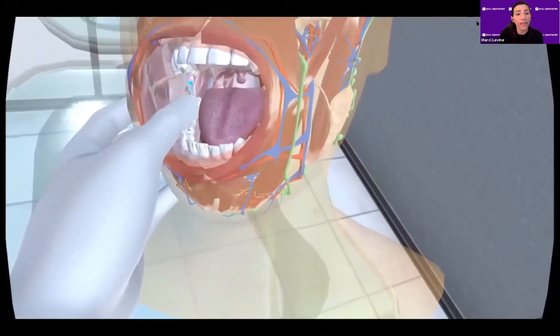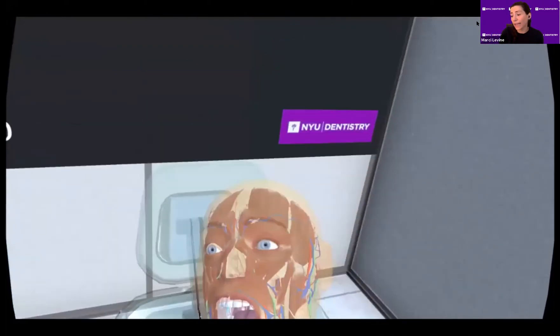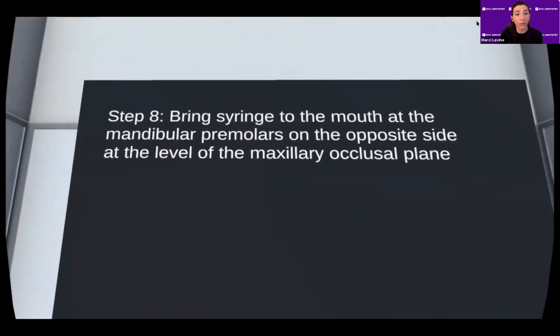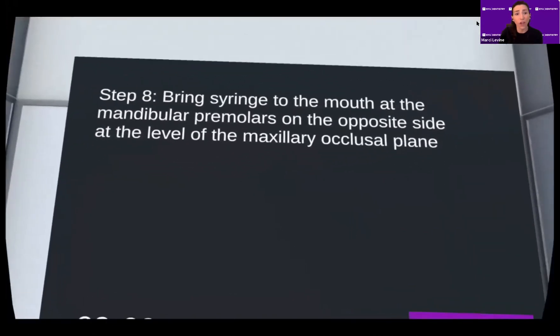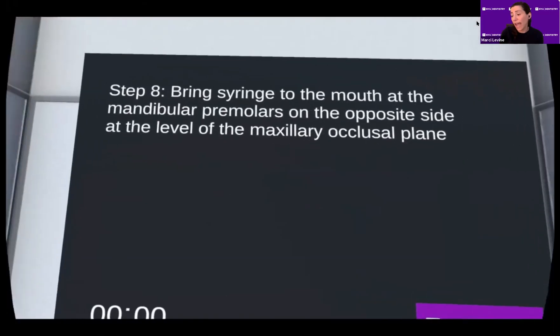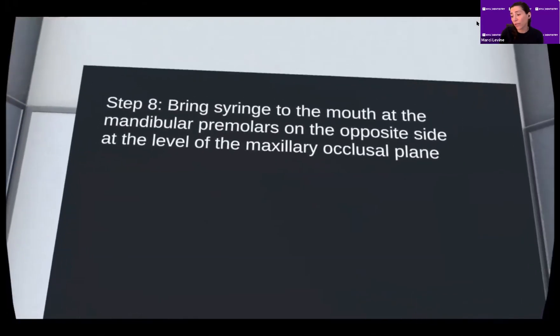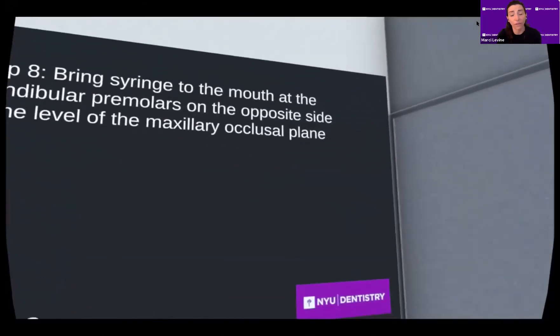You will see that certain landmarks are highlighted in bright blue and also labeled. These include the internal oblique ridge, the external oblique ridge, and the coronoid notch.